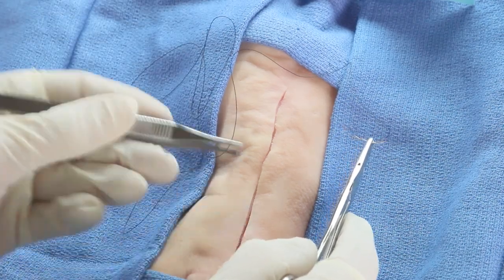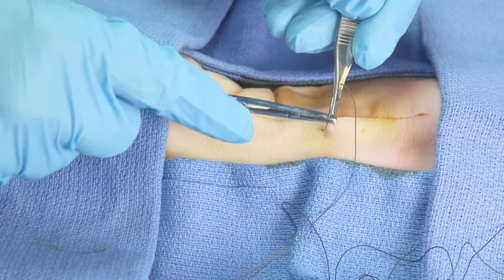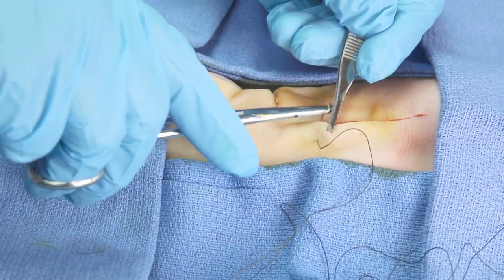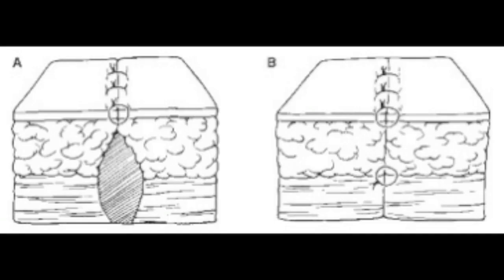With a continuous closure it only has knots at each end, so if one of those knots is bad, the whole thing will unravel. In simple interrupted sutures, the needle should enter the skin at about a 90-degree angle and about a quarter of an inch from the wound edge. Go deep enough to prevent any area of dead space not closed under the sutures. Dead space allows the accumulation of blood, inflammatory fluid, and bacteria below the skin closure, and it could be a source of serious infection. If it's there, you may need a second, sometimes a third, deeper layer using absorbable sutures.